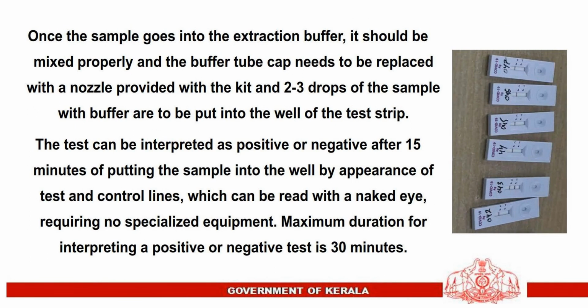Once the sample goes into the extraction buffer, it should be mixed properly and the buffer tube cap needs to be replaced with a nozzle provided with the kit, and 2 to 3 drops of the sample with buffer are to be put into the well of the test strip.